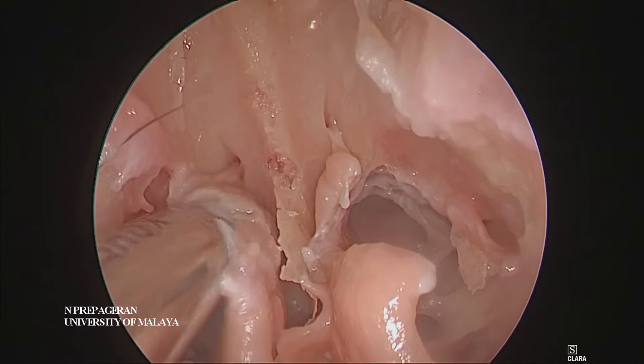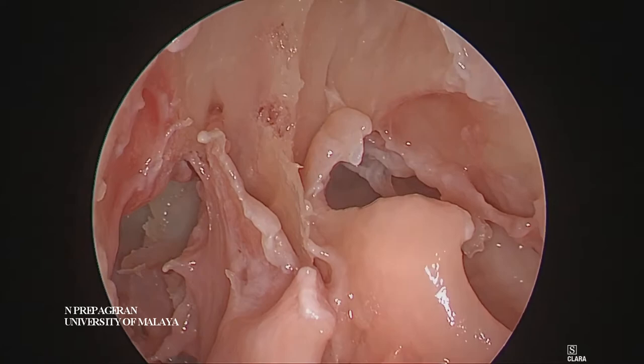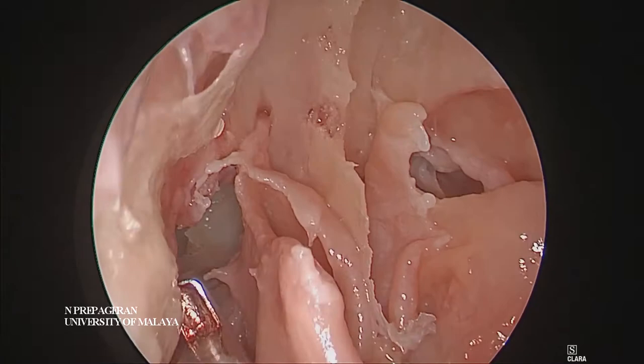All we need to do now is to join both right and left sides. We have found the first olfactory neuron at the back here — that's the first olfactory neuron at the back. Now you can drill, but it will be easier for you to use a Kerrison punch as much as you can.